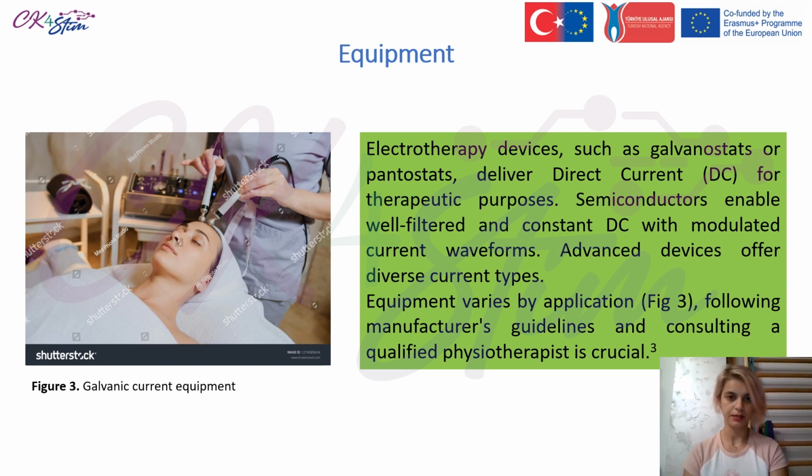In this progressive landscape, sophisticated devices provide an array of current types to cater to different therapeutic needs, tailored to specific applications. The selection of equipment should align with the manufacturer's recommendation.